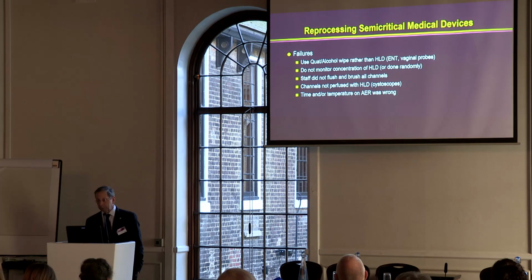So, reprocessing semi-critical medical devices, then failures. Obviously, failure, such as just using a wipe instead of appropriate high-level disinfection. The CDC guideline explicitly says that all semi-critical items should be high-level disinfected, not low-level disinfected.